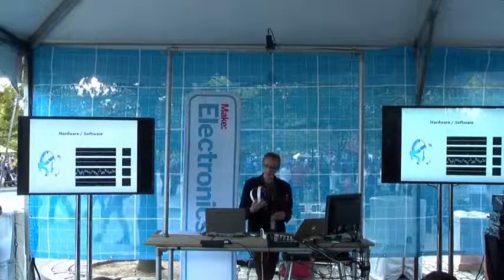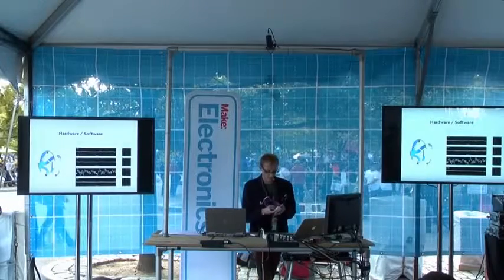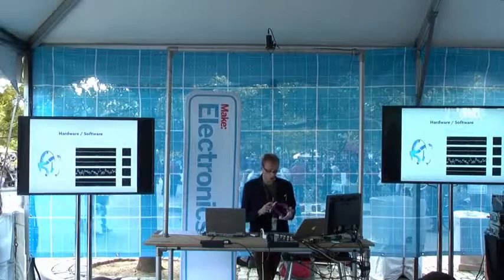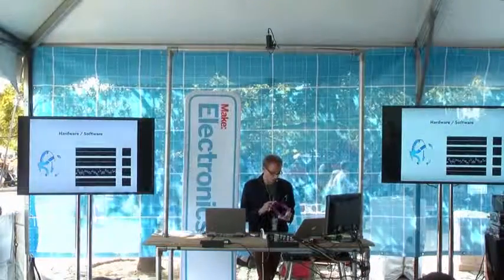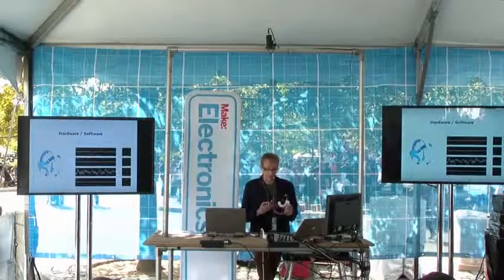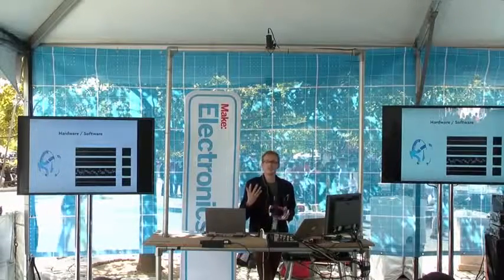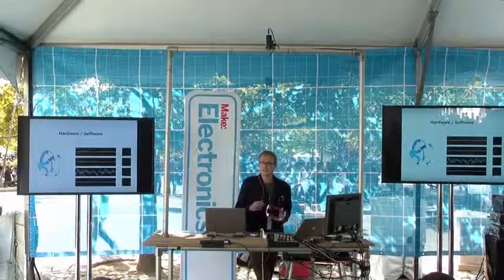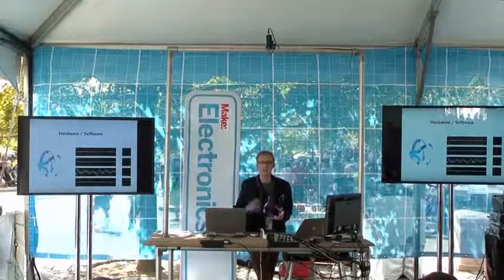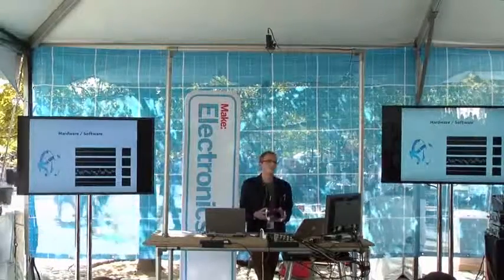The EEG headset itself is designed like this. It has a wireless connection. It also has a microprocessor, and in this example six dry electrodes. You have two different types of electrodes on EEG. You have the wet electrodes, which is a whole hassle because you have to put conductive gel on your head, even shave your head, then conductive gel, and then place on the EEG headset.